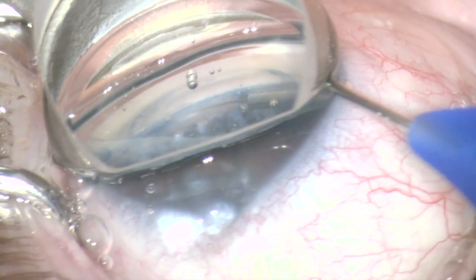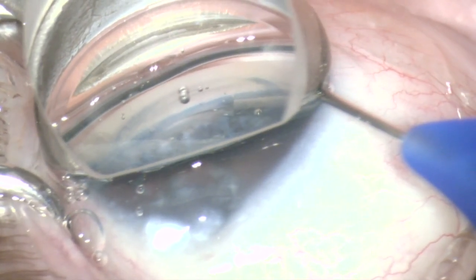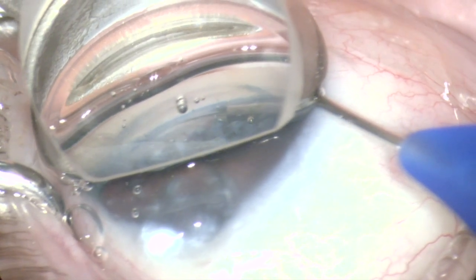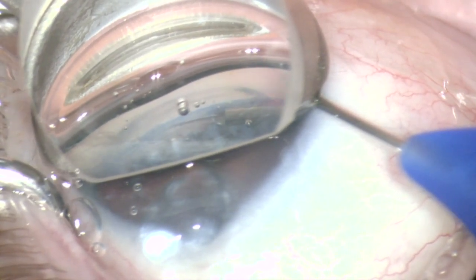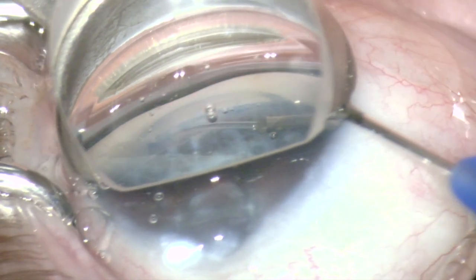As the catheter is advanced all the way around, the viscoinjector is clicked 3 times per clock hour, performing a pressurized canaloplasty. Dramatic blanching can be seen in this example. After the canaloplasty was completed, the routine phaco proceeded uneventfully.